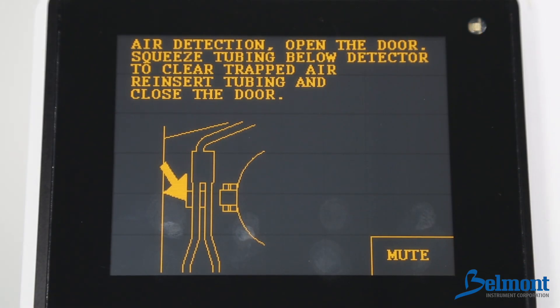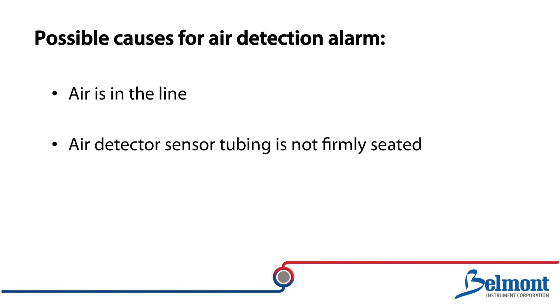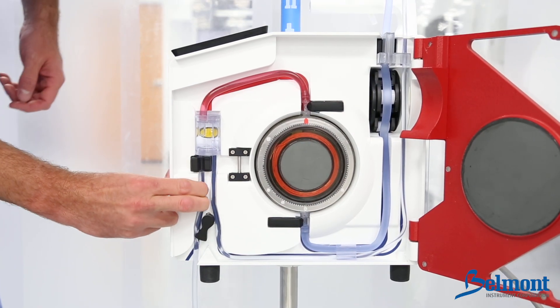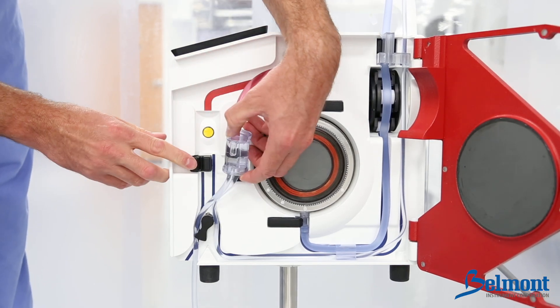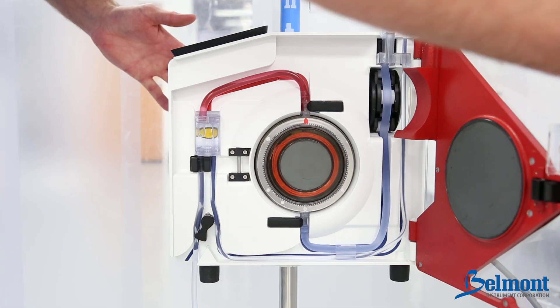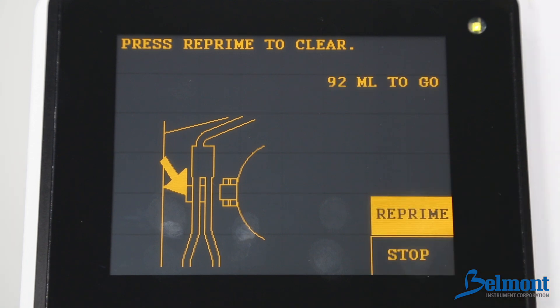The air detection alarm would be triggered if air is in the line, the secondary air detection sensor is not firmly seated, or if the air detector sensor is dirty. First, open the door to silence the alarm. Squeeze the tubing directly below the air detector to clear any trapped air out of the sensor. Check the air detector and make sure that it is clean and the infuse line is properly seated inside the air detector. Finally, press reprime. The system will resume infusion when the repriming process is complete.